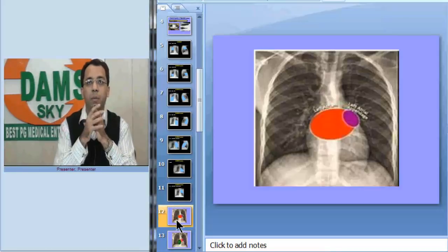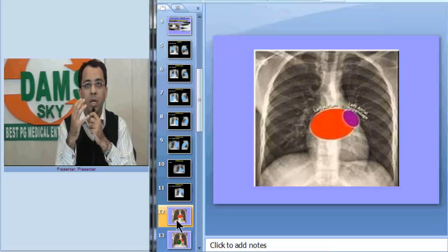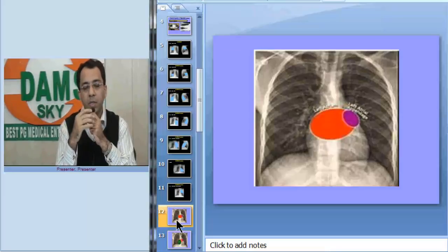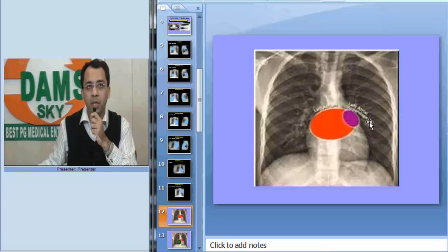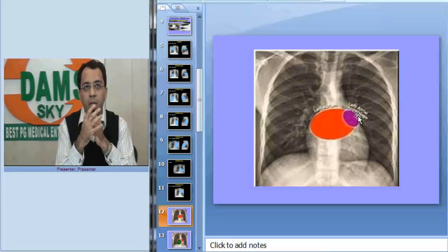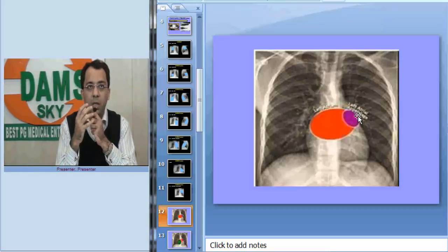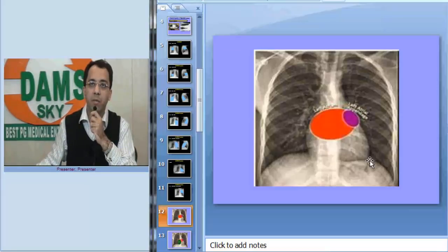Now let us identify the cardiac silhouette. I am building the cardiac shadow from posterior to anterior to show how structures form the cardiac borders on a chest x-ray. The posterior-most part is the left atrium. The left atrium does not form part of any cardiac border, but its appendage — the auricle — forms a small part of the left cardiac border. In mitral valvular disease, the left atrium enlarges, the auricle bulges, and this leads to straightening of the left heart border.